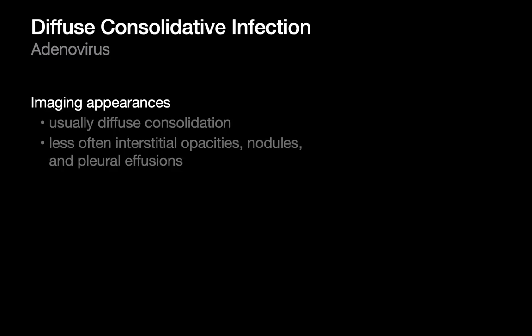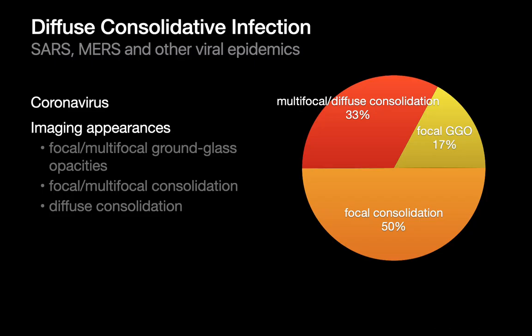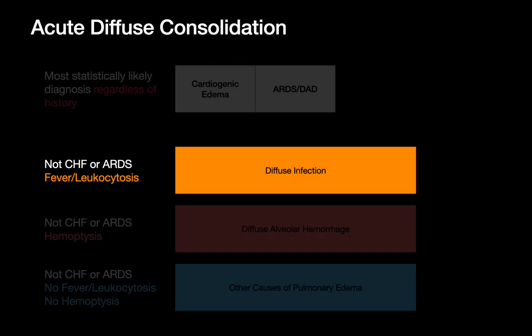Adenovirus is another cause of diffuse consolidation in immunocompetent individuals — here's a nice example. Viral pandemics and epidemics can on occasion result in diffuse consolidation, but as with influenza, more likely to present with no lung finding or if there is a finding, more often non-diffuse. But they can present diffusely. Here's an example of SARS. That's the relatively short differential diagnosis list if you're entertaining diffuse infection as the cause, rather than just CHF or ARDS.